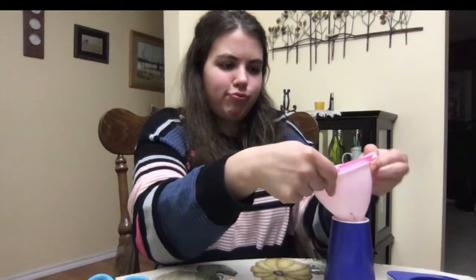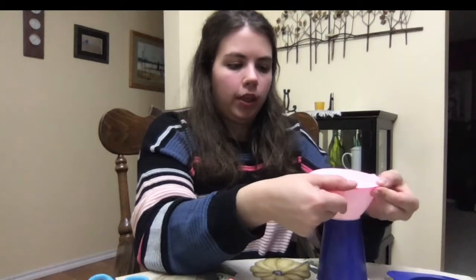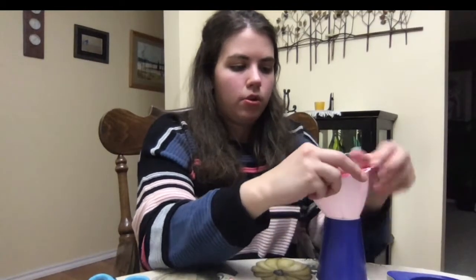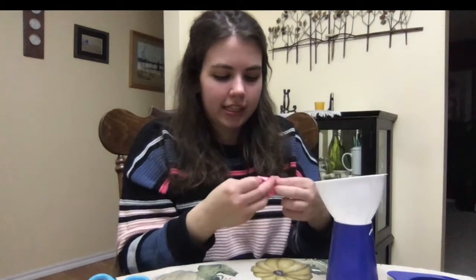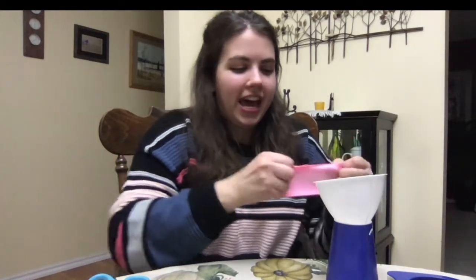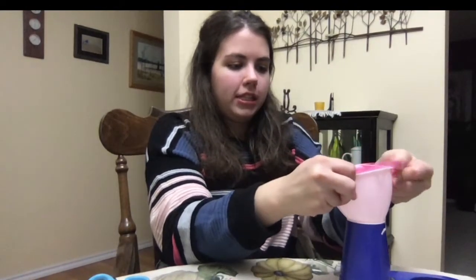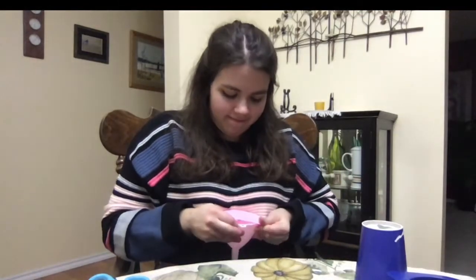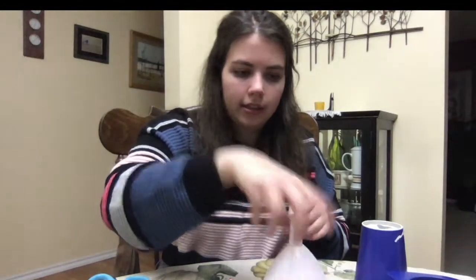And it should probably be tight enough that you won't need to tape it or anything like that. Oops. See, like I said, a couple tries probably. So it should be tight, and you probably won't need to do anything to keep it in place. But if you do, just throw some tape on there, or a rubber band would work too. Okay, there we go. So that's nice and tight on there.